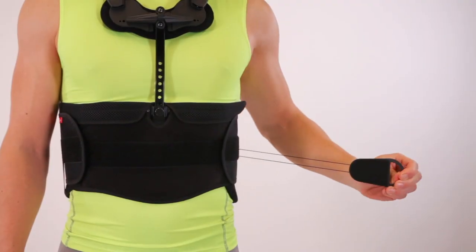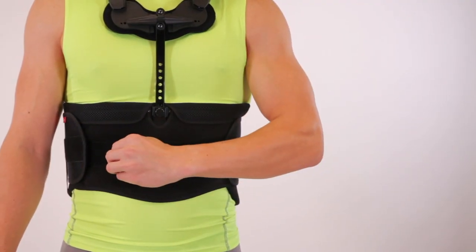Attach to the front panel and readjust as needed.